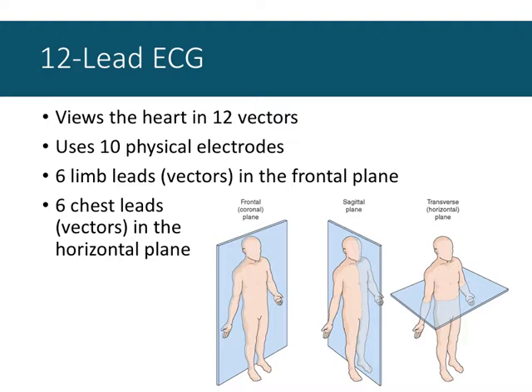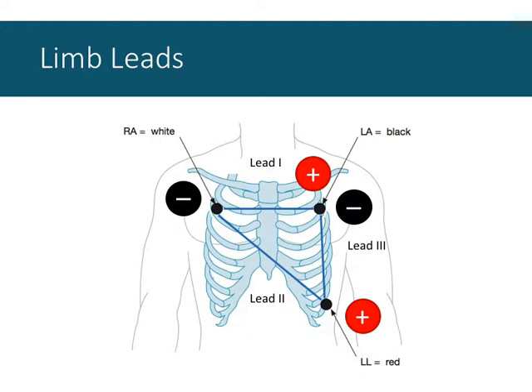So electrode versus lead, a bit confusing now, but we're going to clarify it. We'll start with the classic lead 2 ECG setup that lends itself nicely to also generating leads 1 and 3. The classic setup with Einthoven's triangle here allows us to collect all the information that we normally receive on lead 2. This is exactly the same as the other slides that we've looked at. Negative electrode on the top right shoulder, positive electrode on the lower left hip, or in that region, lower left ribs.